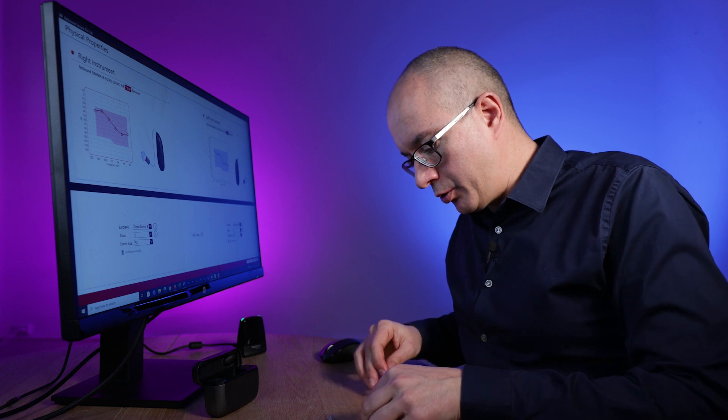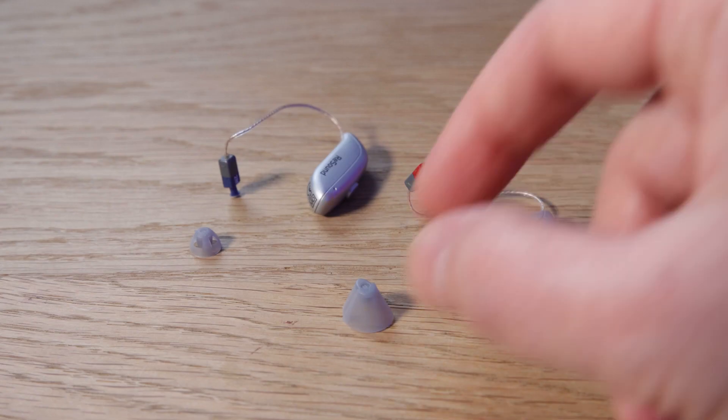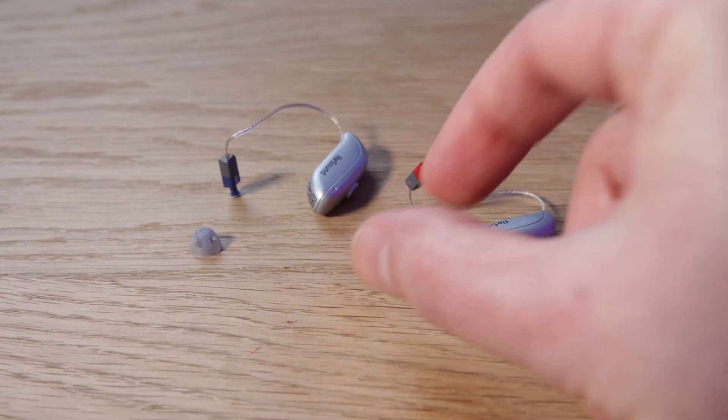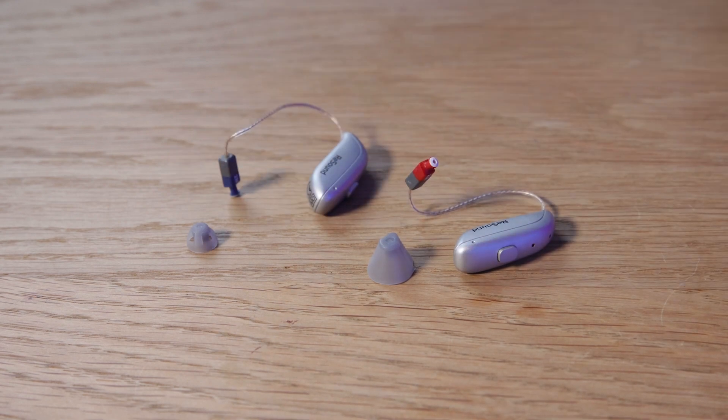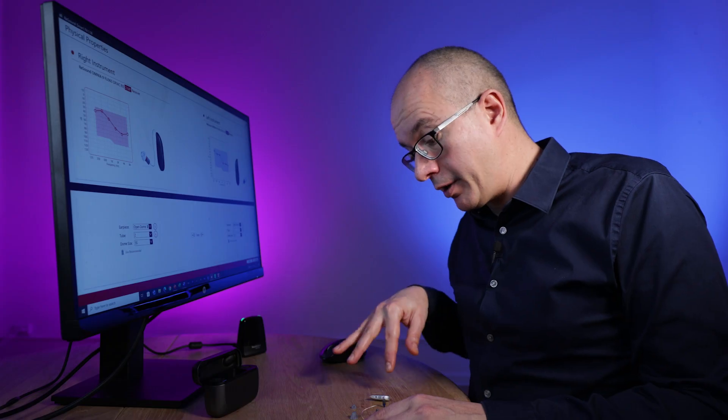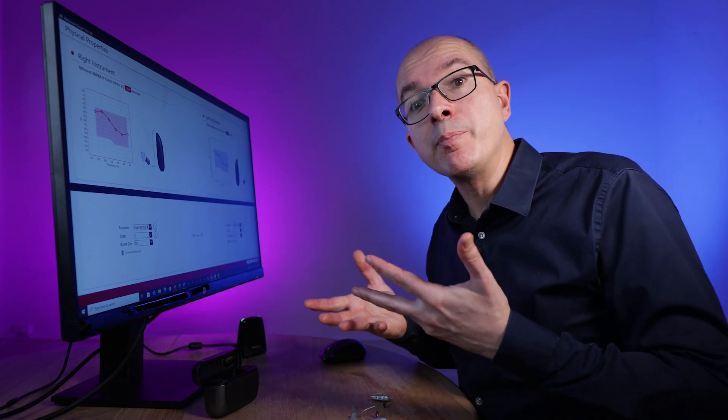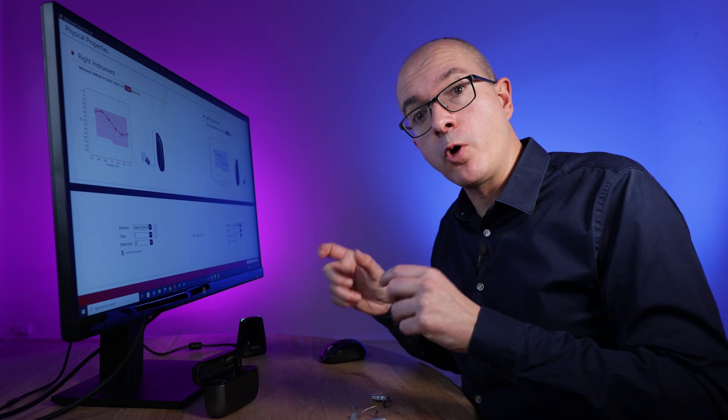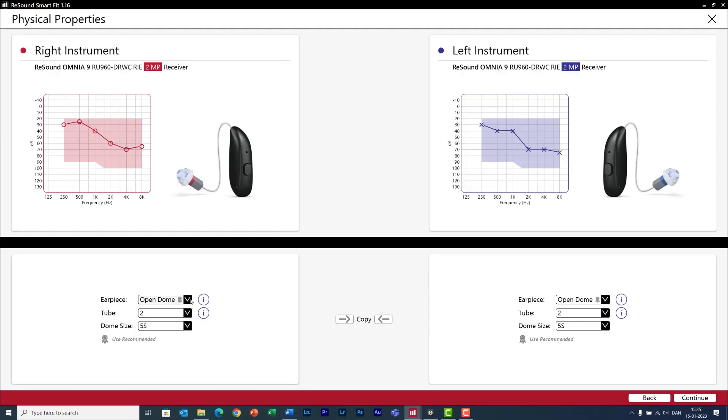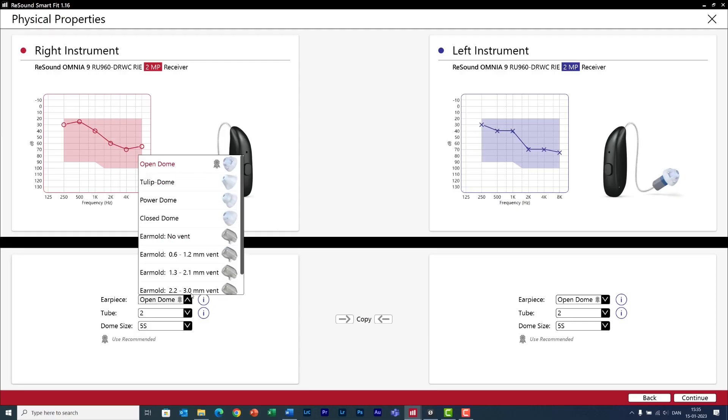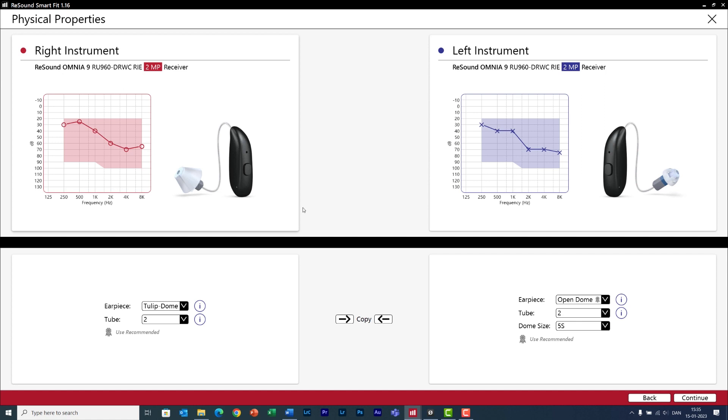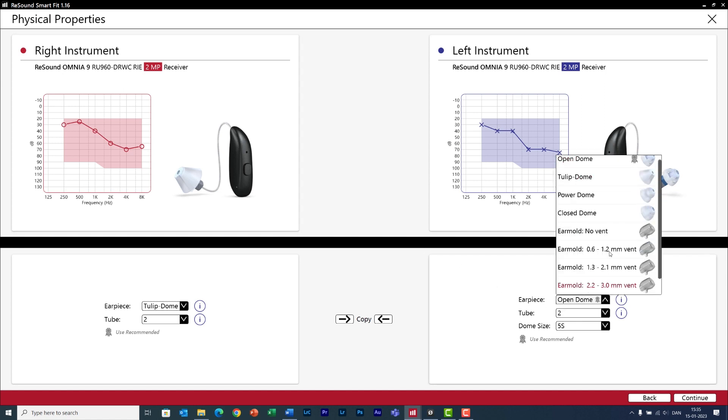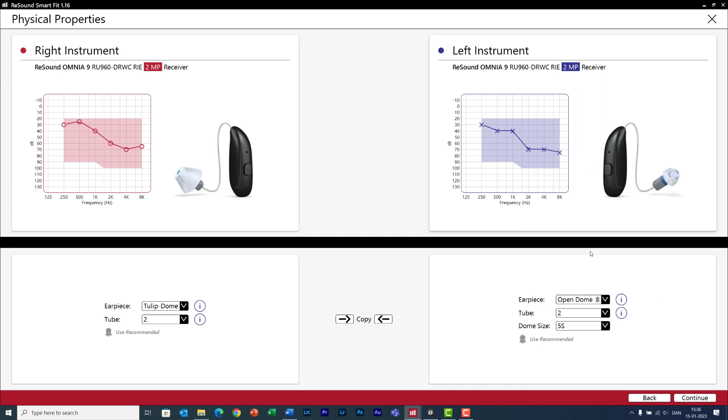In our case I'm going to use a tulip dome for the right ear and an open dome for the left ear, and this is just to show you what is the impact of the dome in the fitting software. Okay so I will select a tulip dome in the right ear and an open dome in the left ear, and I'm using a medium size and now I click on continue.